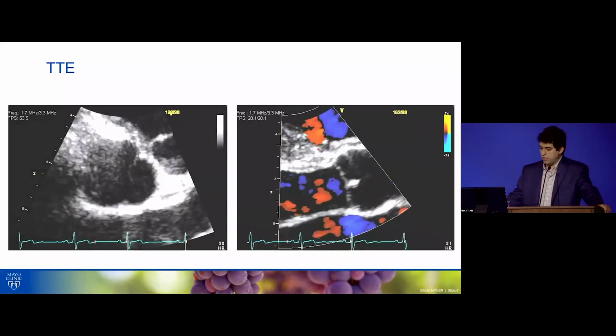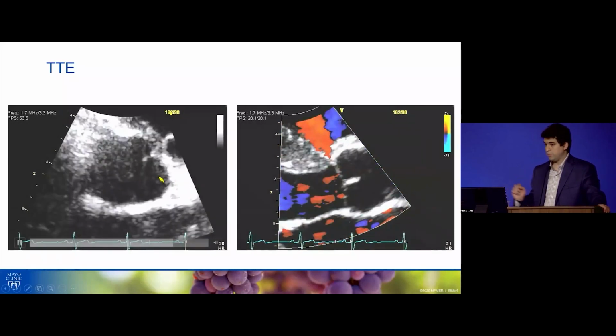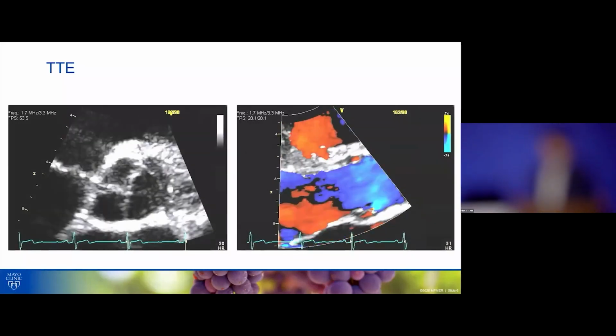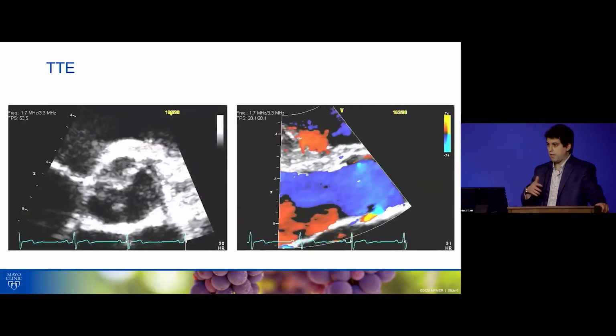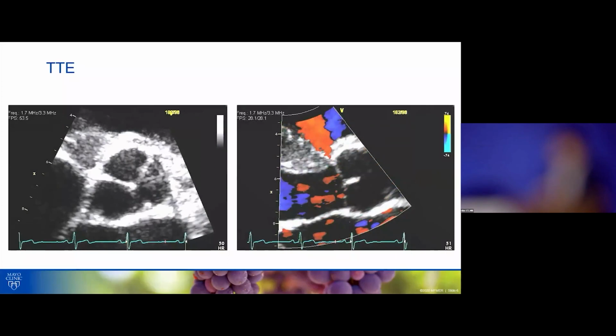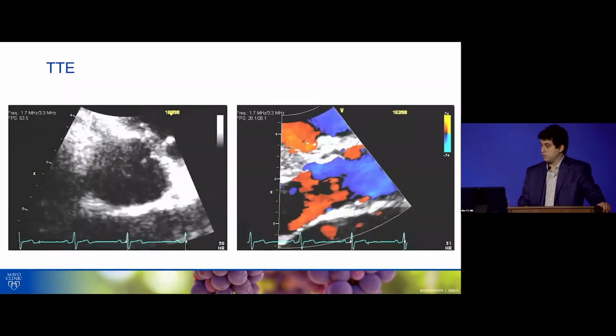But I think, again, you can argue that this is the so-called partial fusion. Some people think that there's no such thing. You're either bicuspid or tricuspid, but it can be very hard. You just pan up and down, and if your parasternal view is not sufficient, you just go to the subcostal. So you just have to try to interrogate all three commissures from different windows.